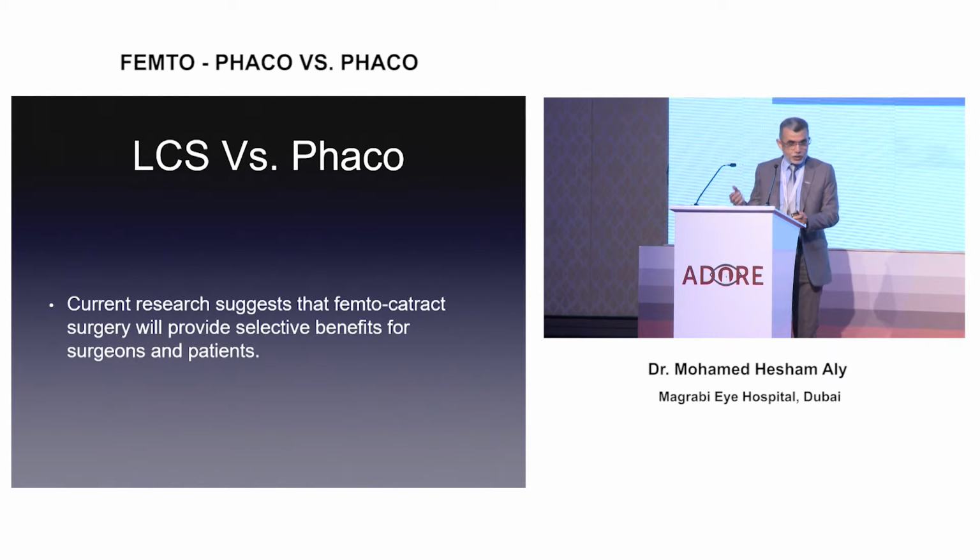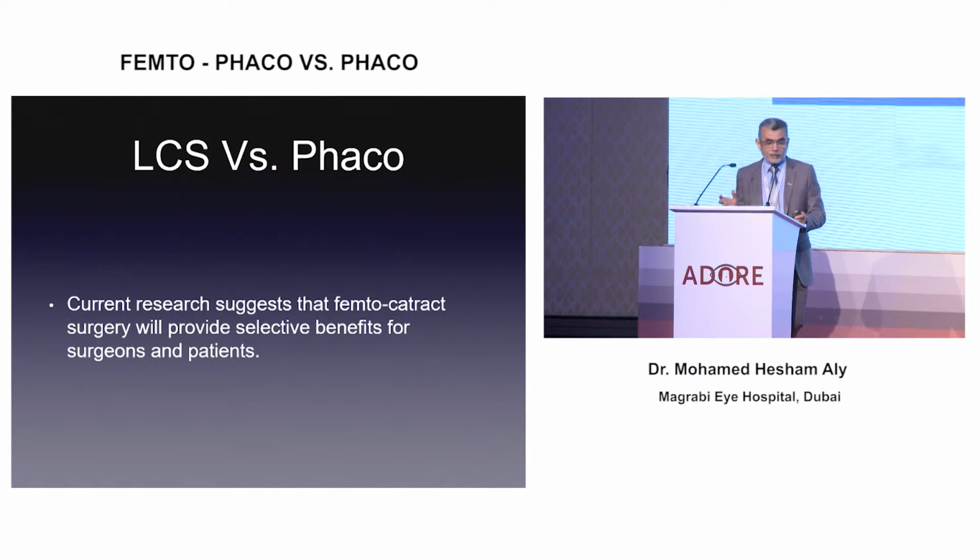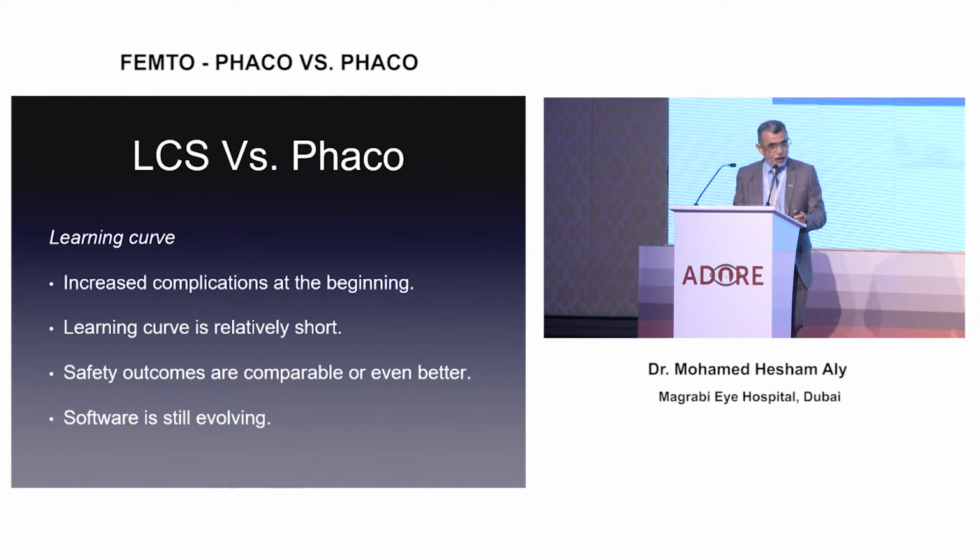The current research now suggests that the femtophaco surgery will provide selective benefits, not all benefits, but selective benefits over the other for some patients. It has a learning curve, but this learning curve is probably shorter than the refractive one. It has more complications in the beginning, especially when the hydrodissection is done, maybe the wound, like Dr. Ammar showed us.